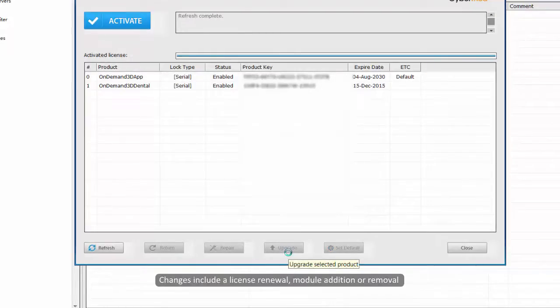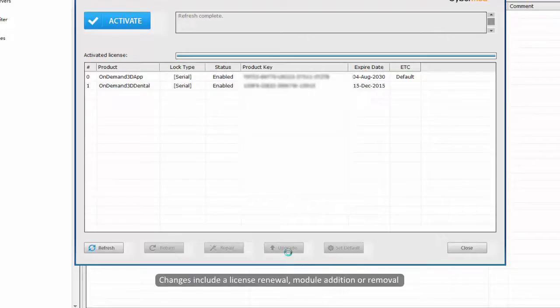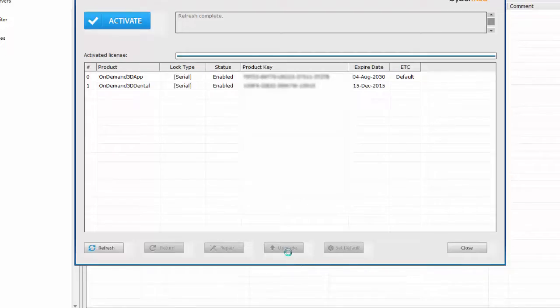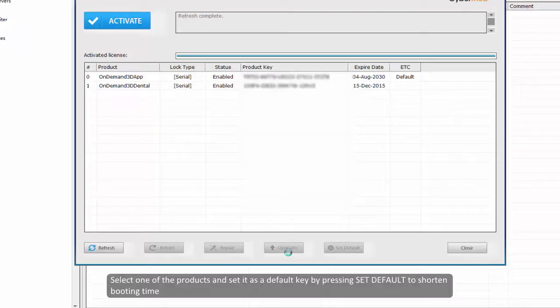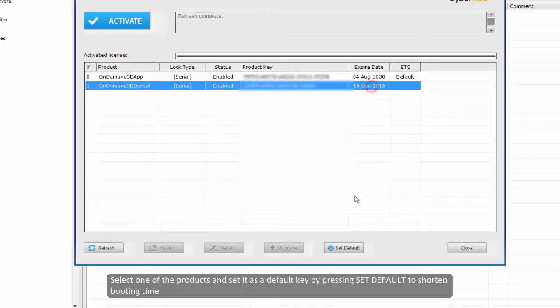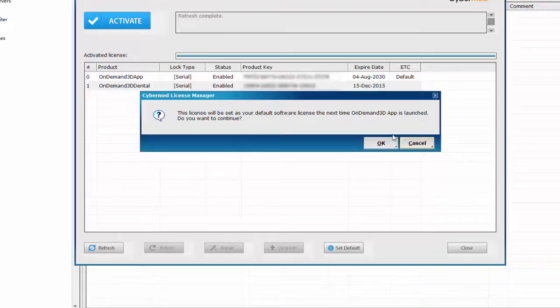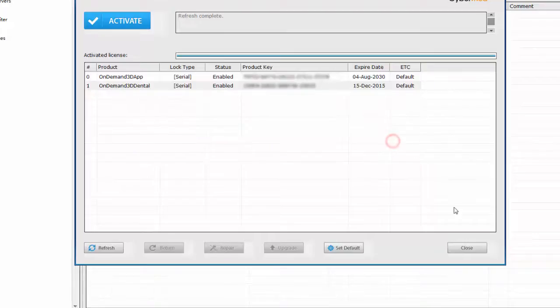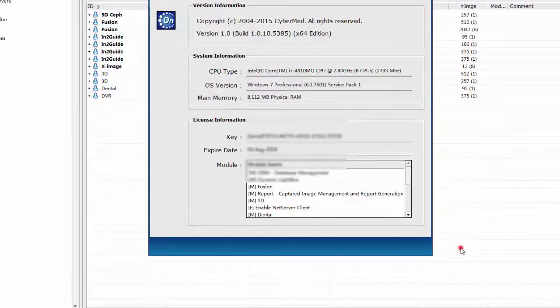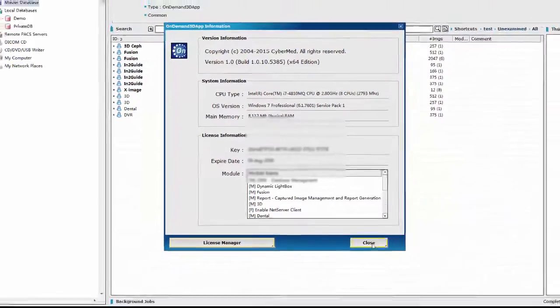Changes include a license renewal, module additions, or removal. Meanwhile, we recommend you to select one of the products and set it as default by pressing the set default button, as this will shorten the booting time. Then press close to close the window.